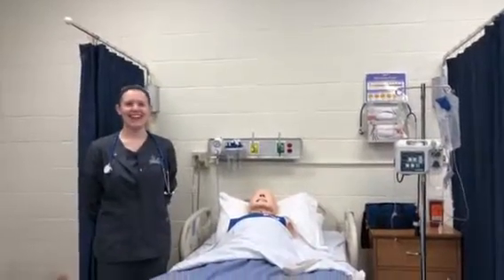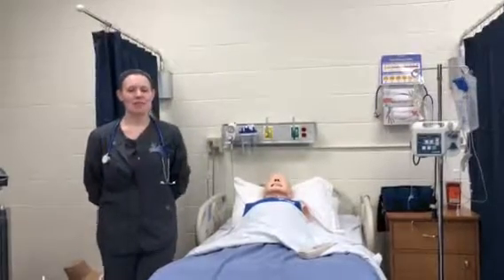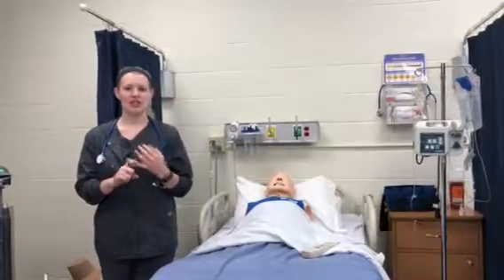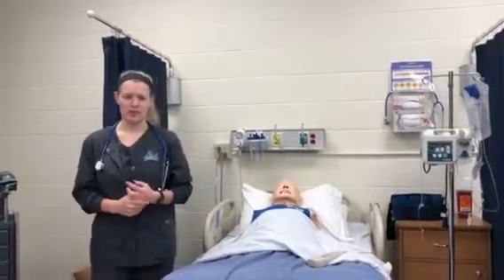Hi, my name is Tristan, and today is September 25th. It's 12:49 in the afternoon, and I'm going to be doing a demonstration of how to insert an NG tube, how to give meds per tube, and how to take out the NG tube whenever we're done with it.